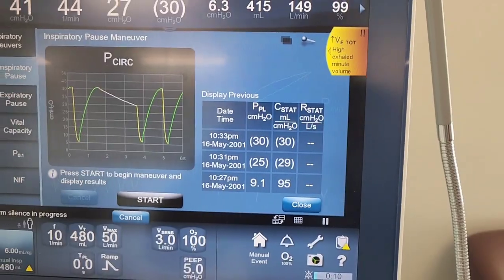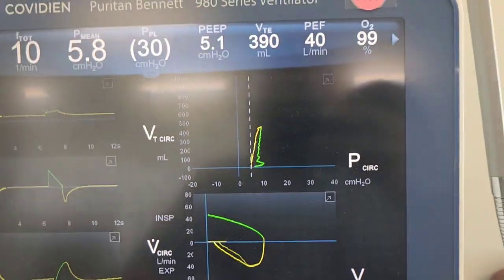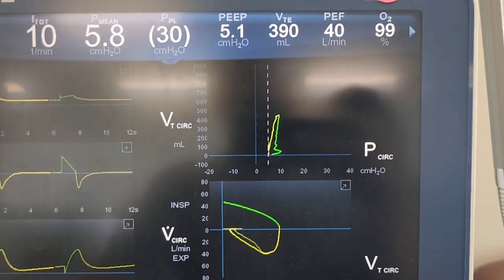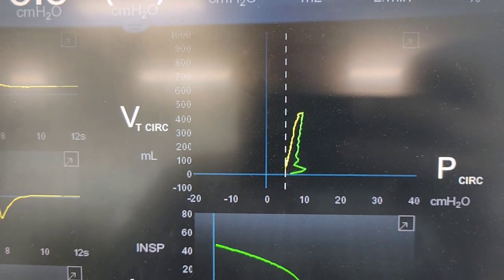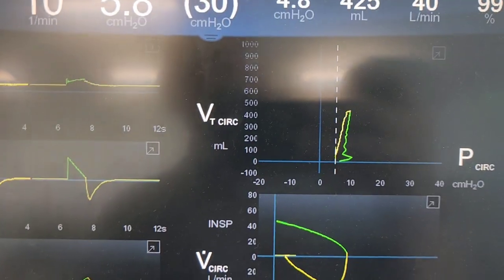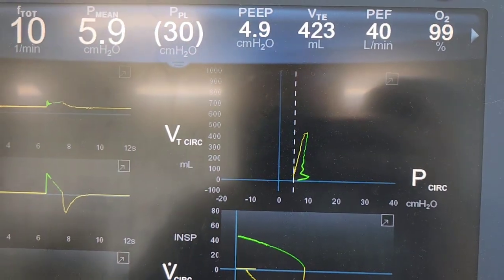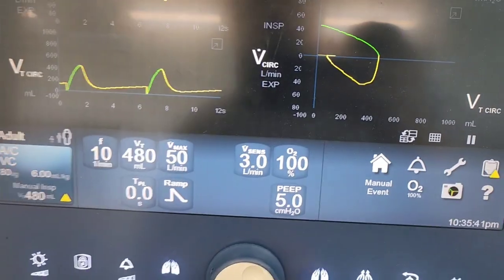I'm going to reset everything on the lung and I'll be right back. Okay, so I'm back. I'm going to go ahead and put some resistors on here, but let's first look at the waveform. Again, with airway resistance, looking at the volume pressure curve, we're going to begin to see that loop get fatter. Okay, that indicates airway resistance. We won't see plateau pressures changing necessarily. Remember, we did a plateau pressure before. Let's do it right now so we can get a baseline.